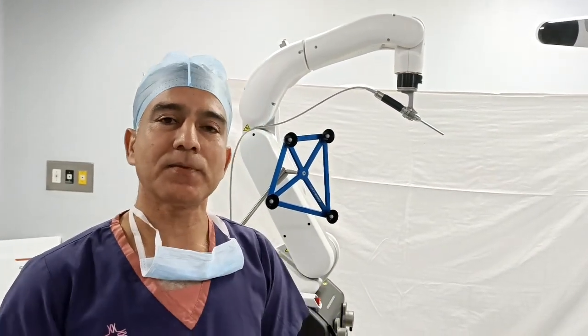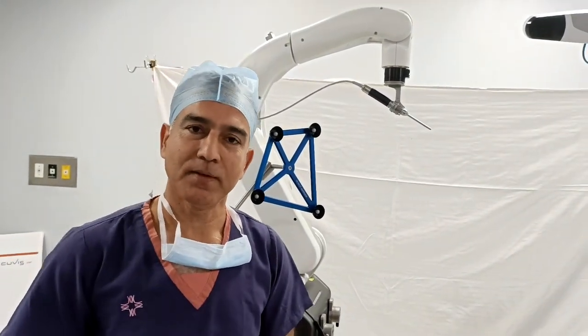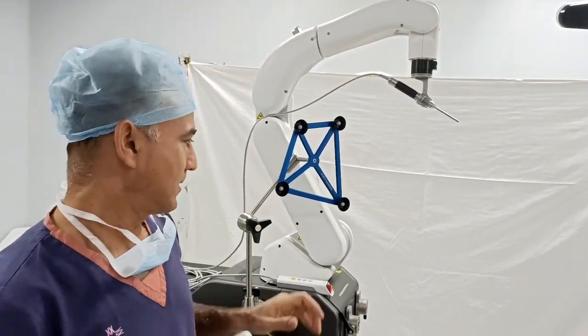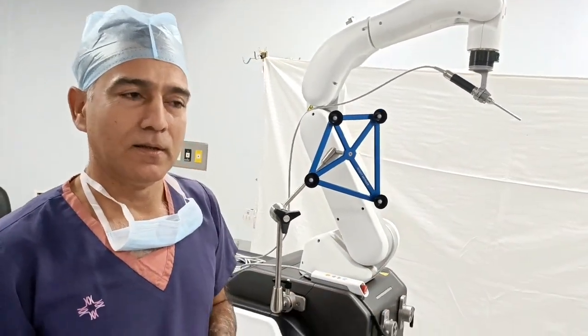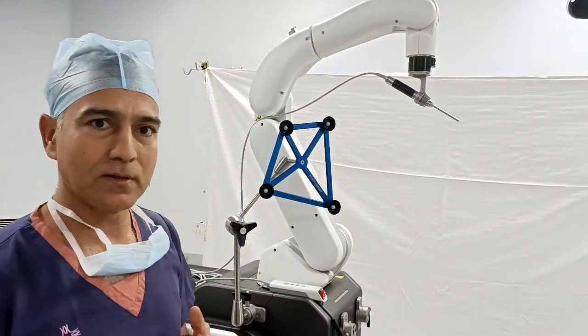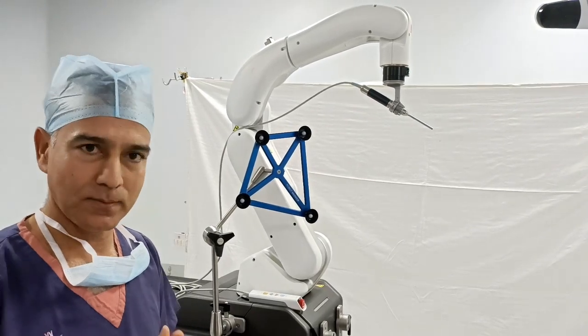Welcome to the Minomax family. Today we have a new member — a very important member in our team. This is the robot, and it is meant for joint replacement. We can perform robotic knee and hip replacement with it.